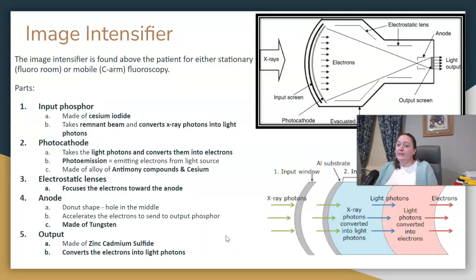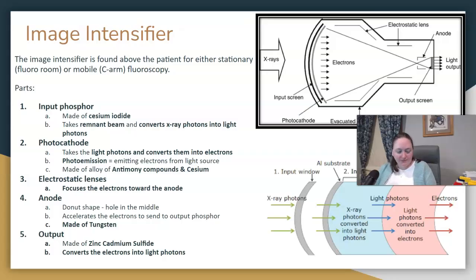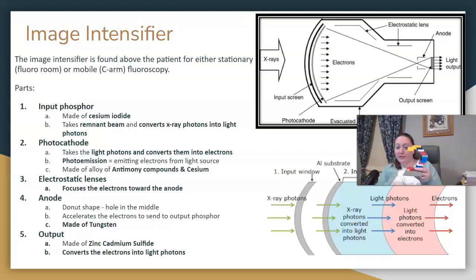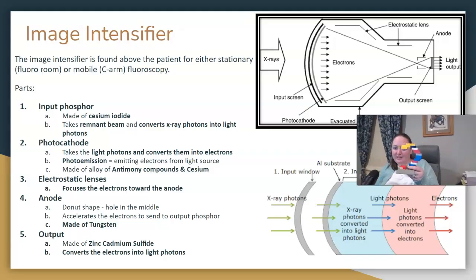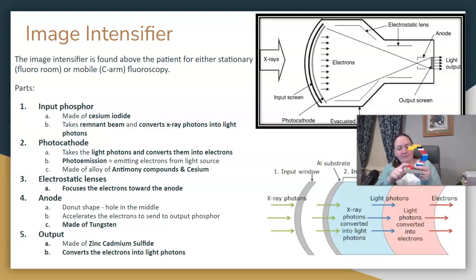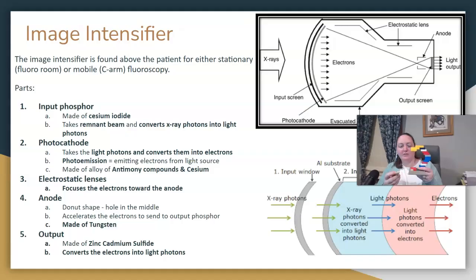How do we convert x-rays into an image we can see using the image intensifier? The image intensifier is going to be above the patient. Here is my LEGO C-arm that my husband and son built me for demonstration purposes. Your x-ray source is at the bottom, the image intensifier is at the top, and the patient on the OR table will be in the middle.